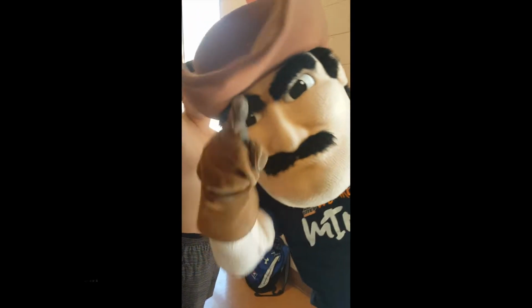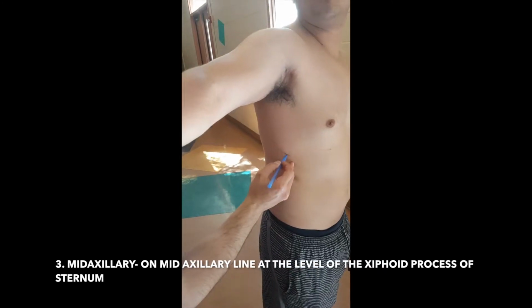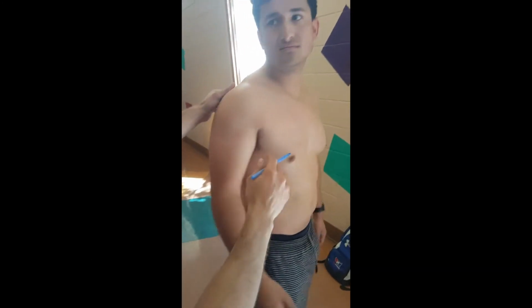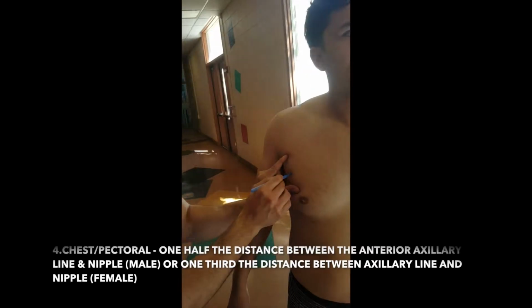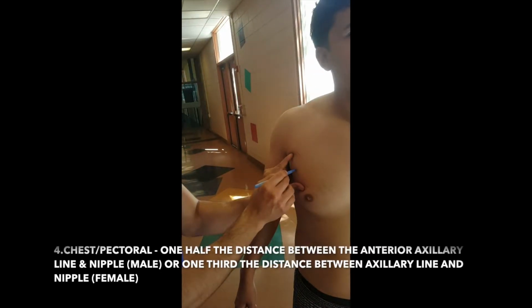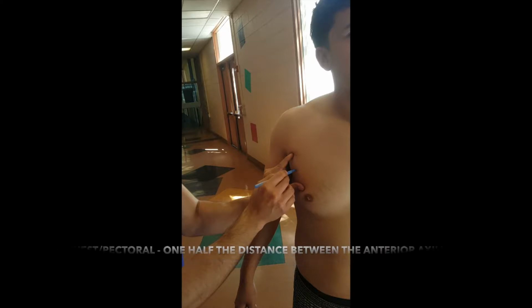Our mid-axillary mark will be located at the level of the xiphoid process on the mid-axillary portion. Our chest or pectoral measurement will differ whether you are a male or female. For males, it'll be 1/2 the distance between the anterior axillary line and nipple, or 1/3 the distance if you are female.